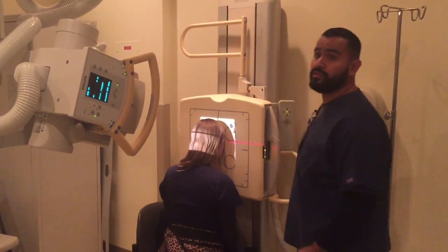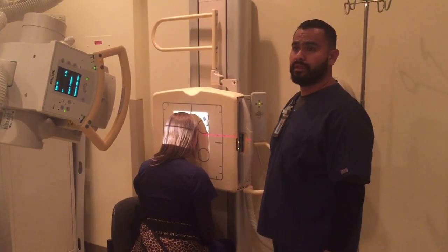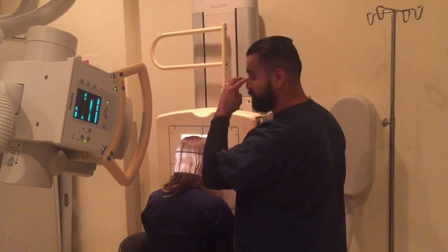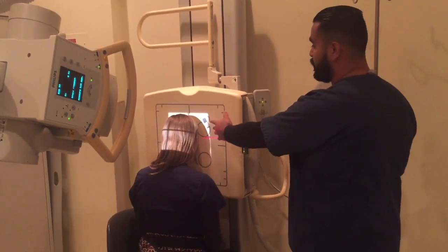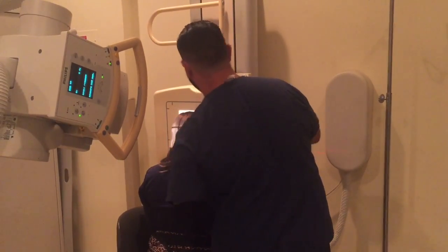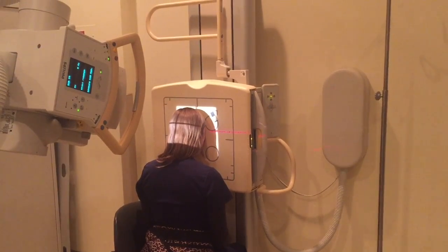And when positioning my patient, you want to know that the OML is perpendicular to the IR, and the MSP is perpendicular to the IR also. So now I will position that, and I'm making sure that my central ray is going to exit through the nasion. The patient's nose is centered at the center of the bucky. So I will position. Alright, I have my marker on the right side. I will now take the x-ray. Hold your breath, don't breathe. X-ray.